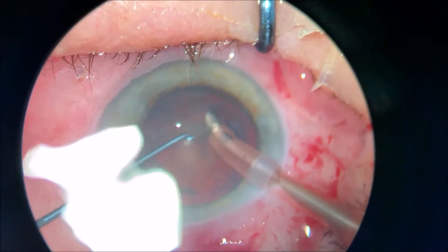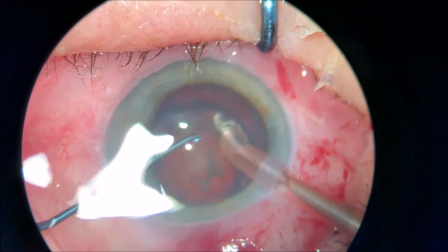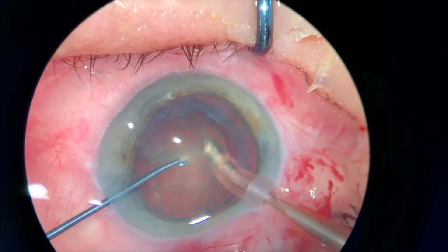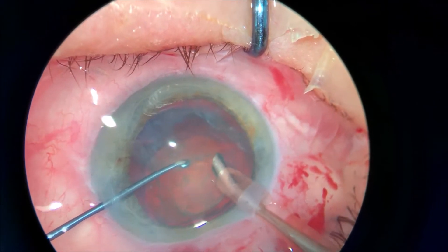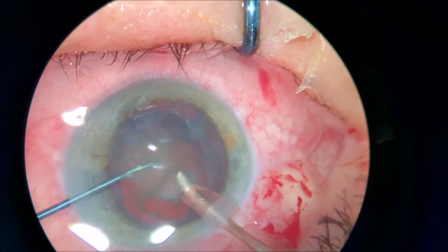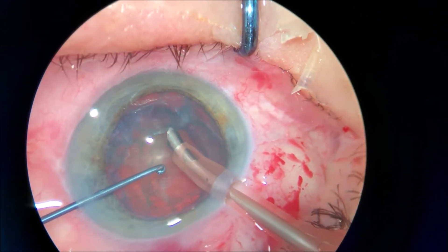Dear colleagues, those are two cases of what I call very successful, very quick and easy and nice surgeries. If you try to do a perfect surgery, you might end up failing a lot.